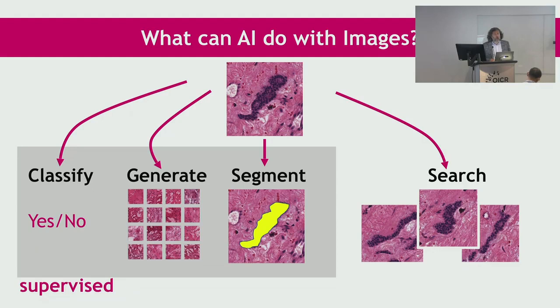In the non-digital pathology, the pathologist does it, and he or she writes a full-scale report, and has to justify it, and has to take the responsibility for it. So we have the pathology report. This is the justification. I look at it, and this is how you describe it. I will show some example.